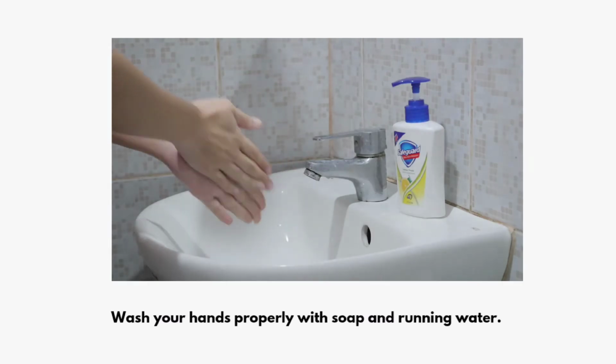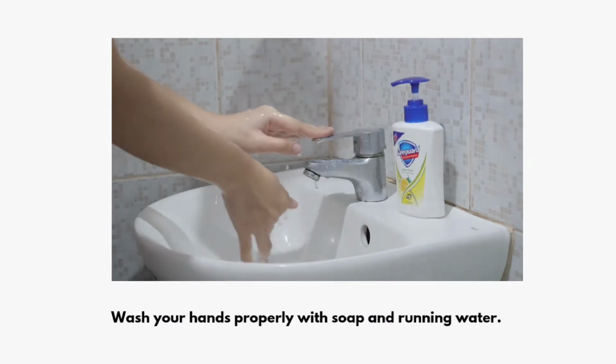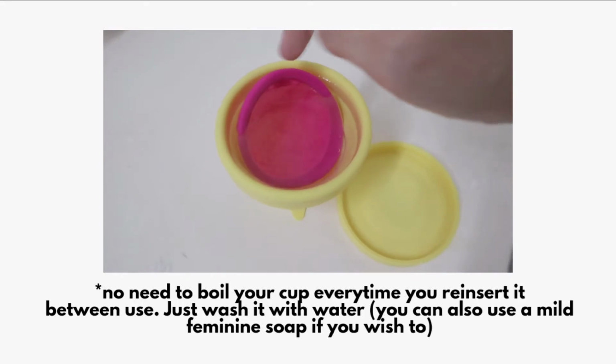I always make sure to wash my hands properly with soap and water before using my menstrual cup or disc. I boil my cup for a good 3 to 5 minutes before using it.